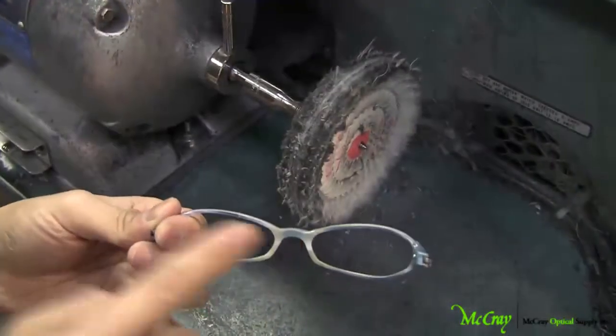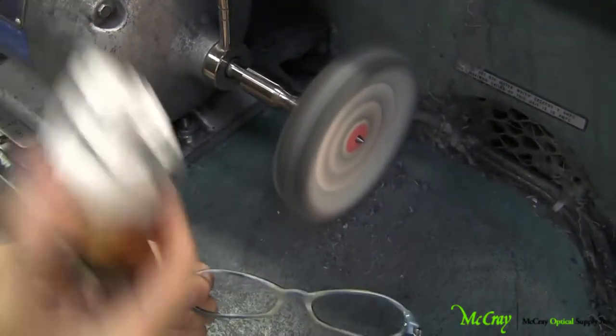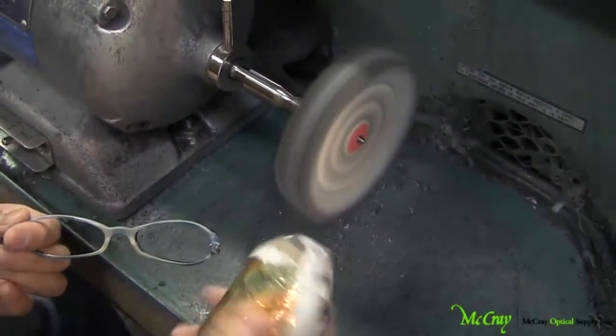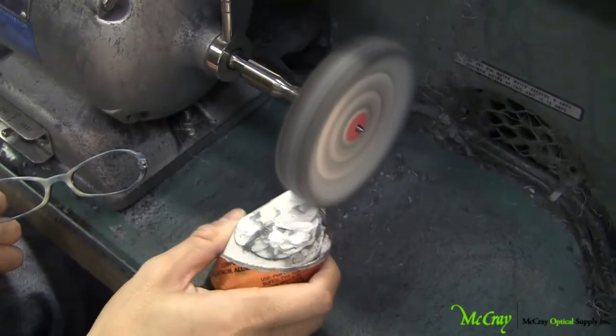Now, we're going to apply with an actual large buffing wheel. The large buffing wheel, again, you have to use the wax compound. And this will just, again, make it that much shinier and bring out that luster in the frame.